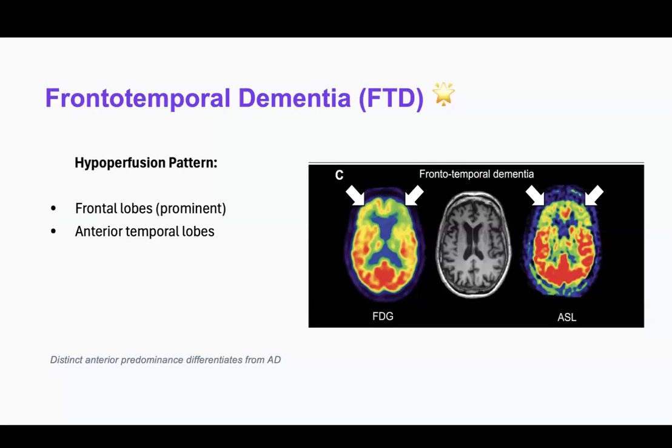In minor cognitive impairment, also we will have hypoperfusion can be present in this patient.